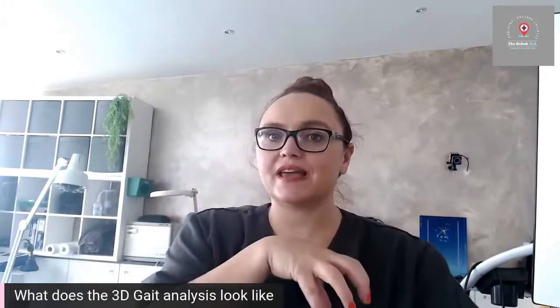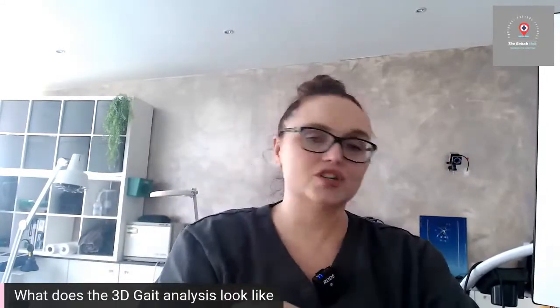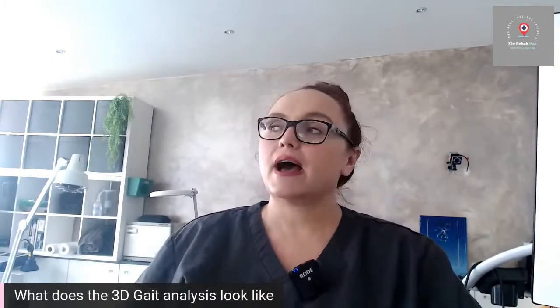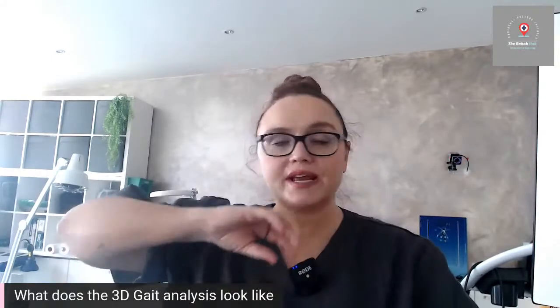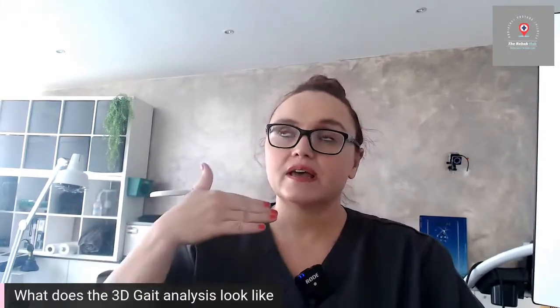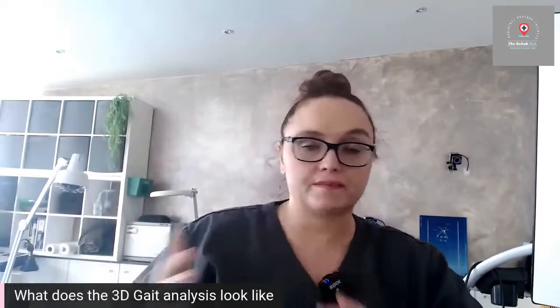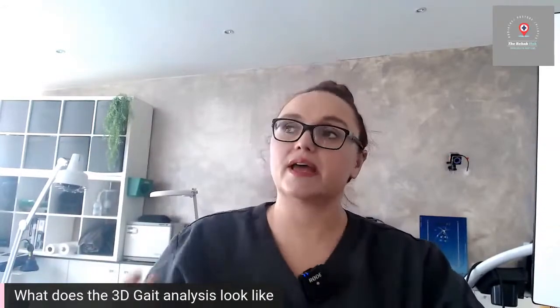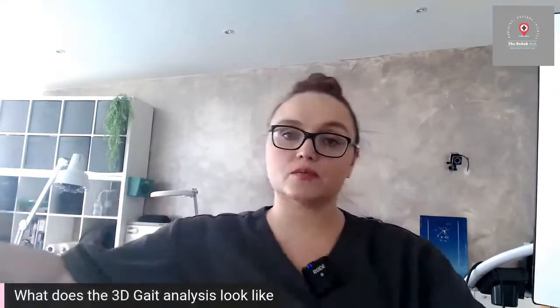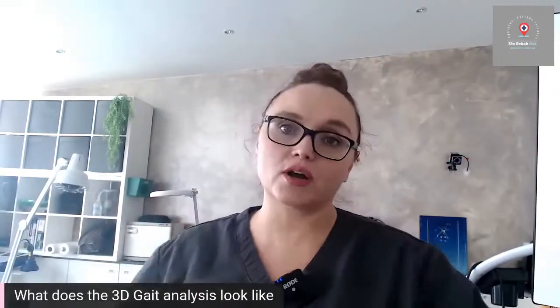When you come in and get this, the assessment takes about an hour and a half. It's a really thorough assessment. From there, we then analyse that even further. You get a full report of your findings that we can help you with in-house, or we can pass that on to maybe a physio you're already working with, or maybe you've got a coach or a personal trainer.